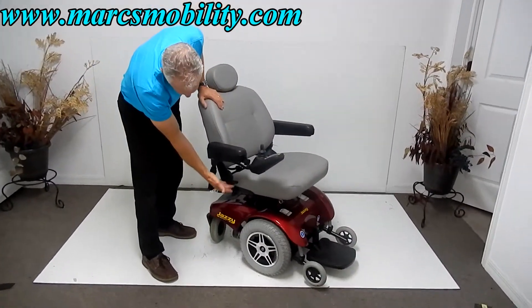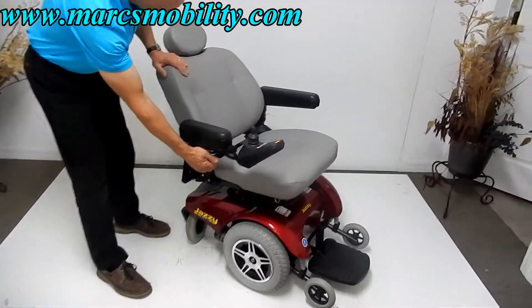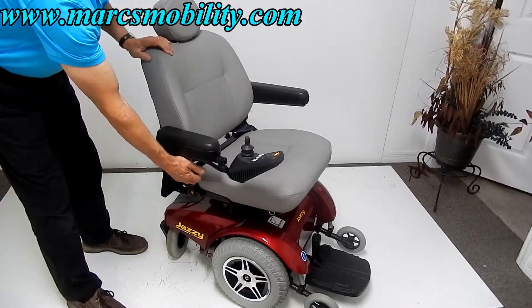The arms also go out if you need to. The seat is an adjustable seat — you can see the handle right here. Using this handle, you can move the seat back or forward.